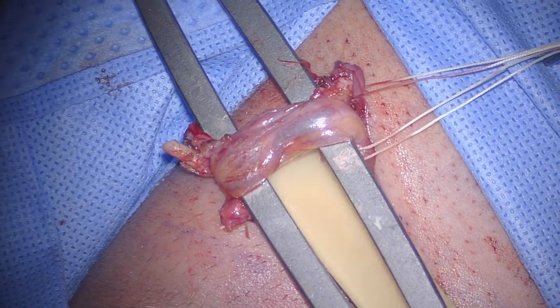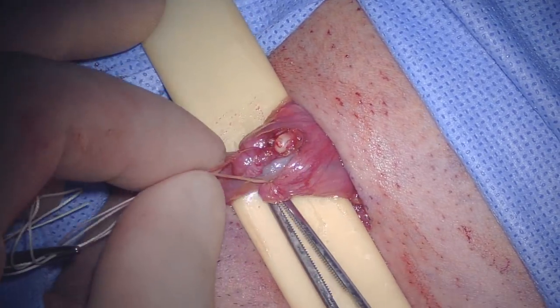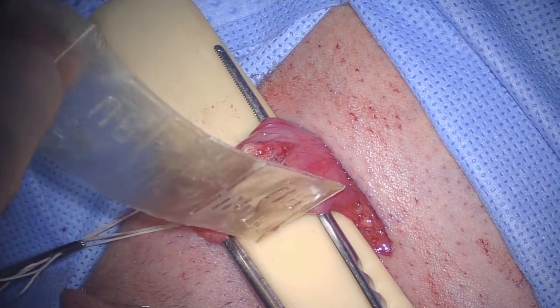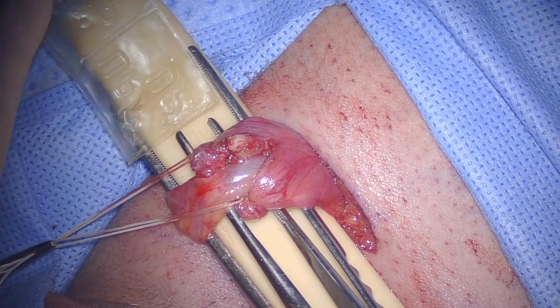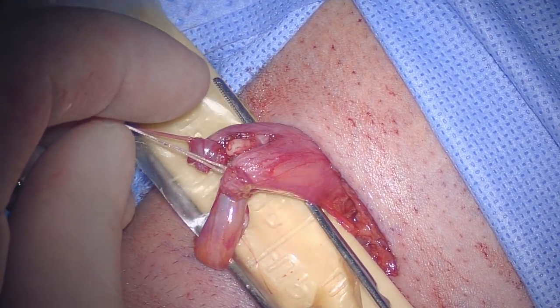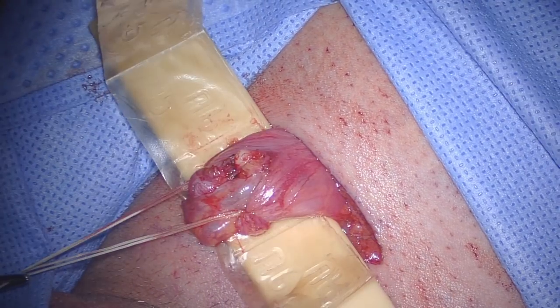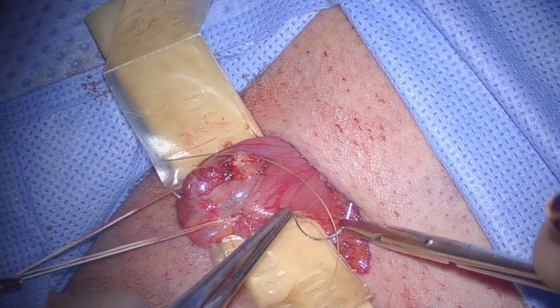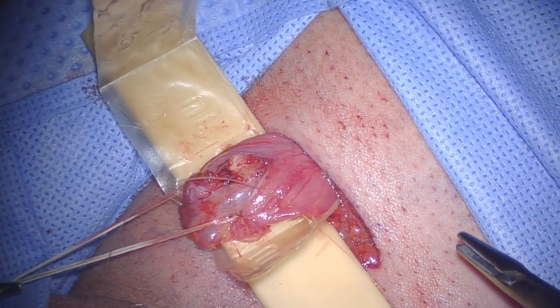A tongue depressor and Penrose drain replace the Army-Navy. An amniotic tissue membrane is then placed around the cord structures with the correct orientation. Chromic suture is used to anchor the amniotic tissue membrane to the cremasteric fibers.